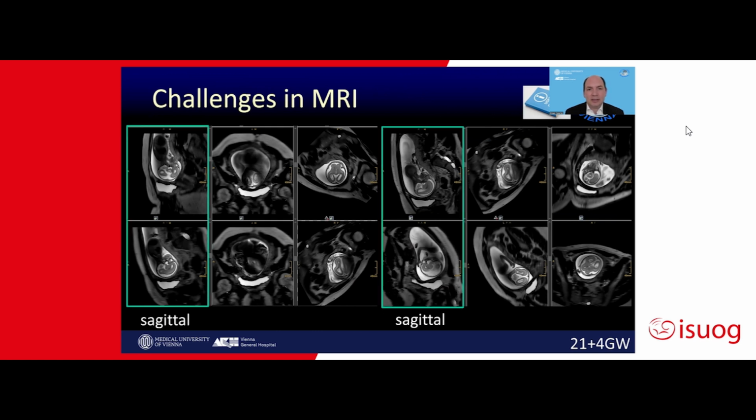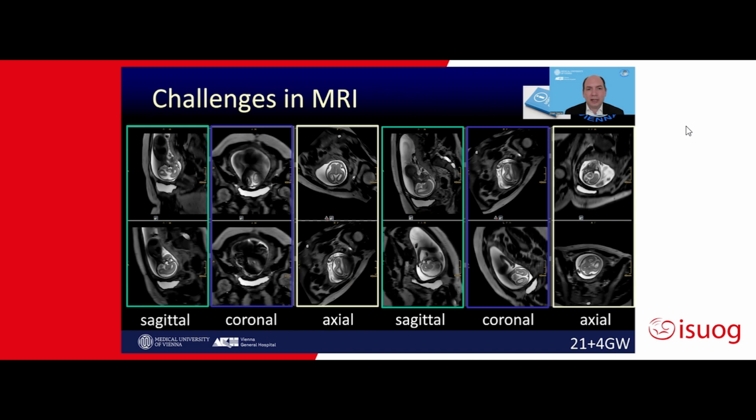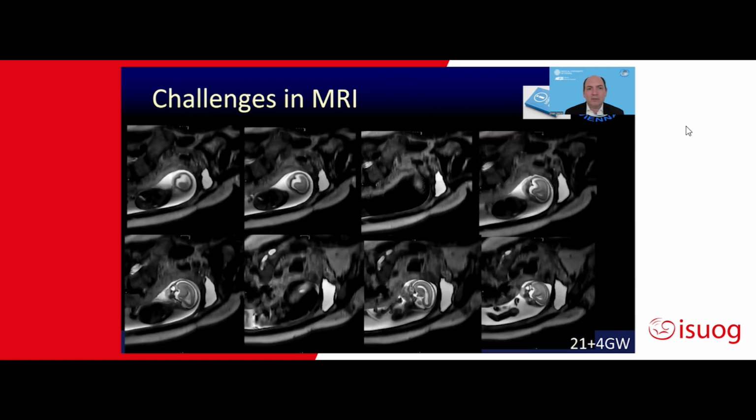You try to get images which are sagittal, coronal, and axial, and out of those you have to be aware that often we are seeing a lot of motion artifacts, and we can only focus on those with the most optimal quality, and those we pick for our evaluation. Meaning, this is an examination happening not only by hitting a button, it's very interactive. We are always checking what is the quality of the images we are provided with.